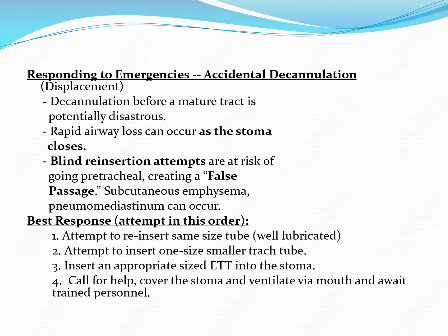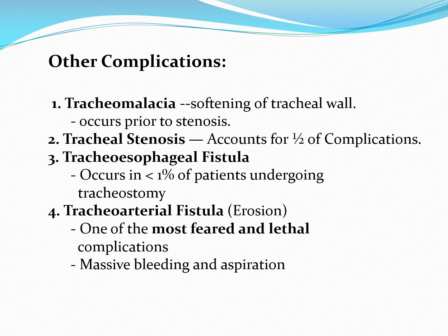Insert the appropriate endotracheal tube in an emergency just to get an airway in place, and obviously calling for help. You can cover the stoma and ventilate the patient via bag valve mask. Again, I don't want to say a last resort, but that would be an extreme measure. Other complications include tracheomalacia, which is softening of the tracheal wall, occurs prior to stenosis in many cases.